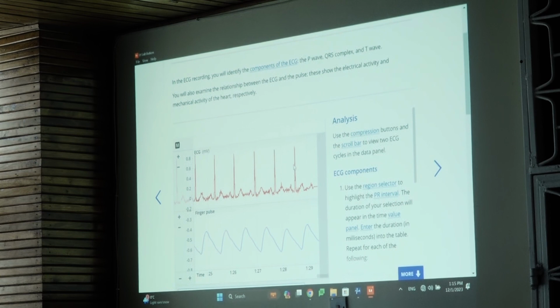You have low pass or high pass filters, or a mains filter that filters out any 50 Hertz frequency from the electricity grid. If you have fluorescent lights, you sometimes have interference. You can manually adjust these filters in the research software, and for simplicity in the education teaching software, we have done it automatically.